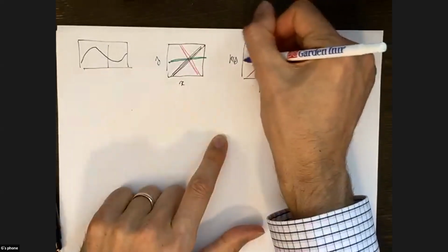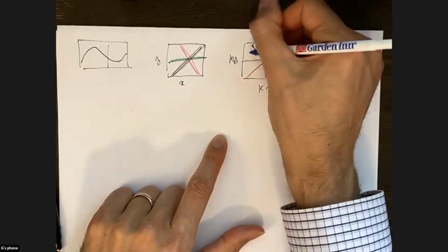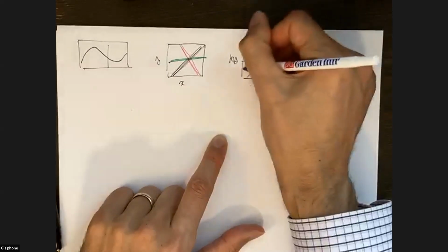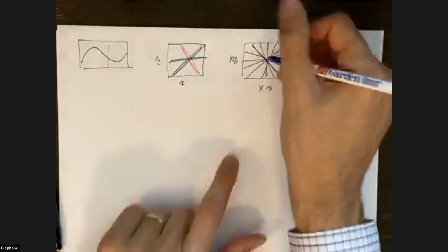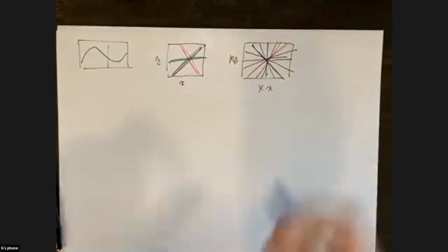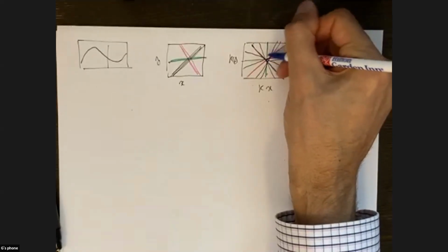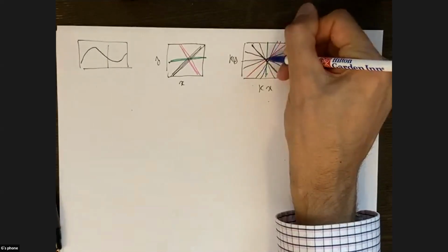projection views, in the frequency domain, we're filling in the spectrum, but it's not being done in a uniform way. Especially the low frequencies get sampled over and over repeatedly, and each time we're sampling a new projection view, we're sampling the DC term and adding it up.